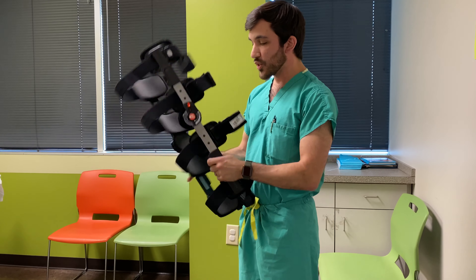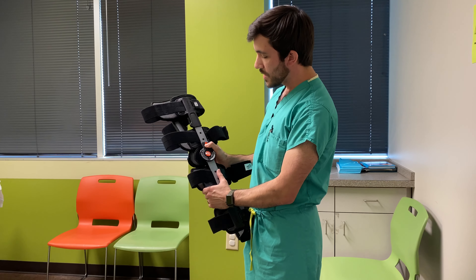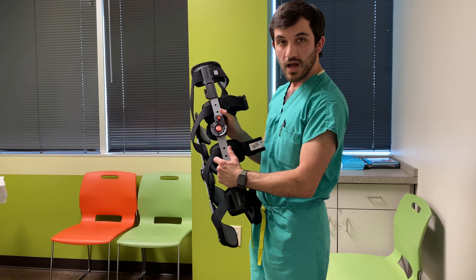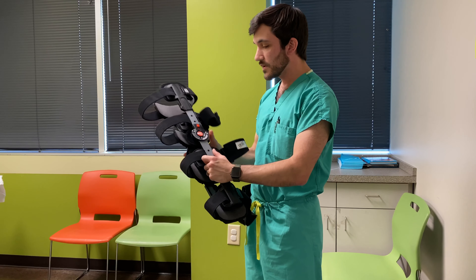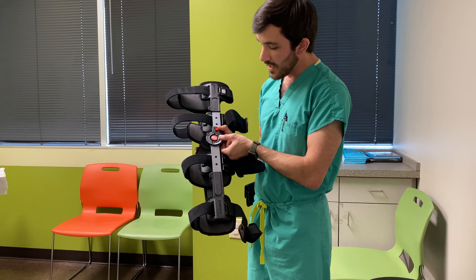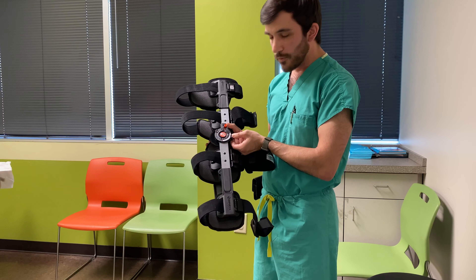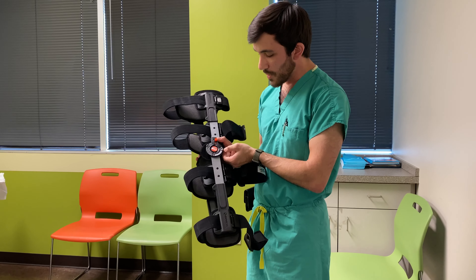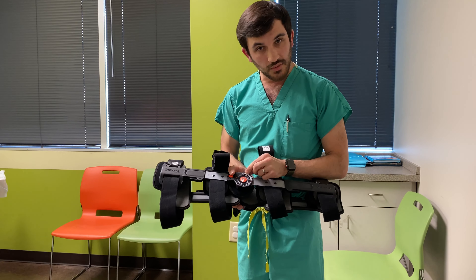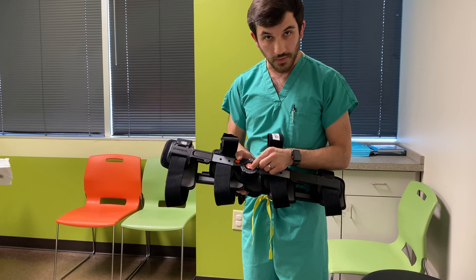The brace is very rigid right now because of the lock button. If you push it up, you'll be able to move the brace. Push it down and it'll lock back in position. How much the brace can move is dependent upon these gray tabs. If you need to change it, you can pull it up and adjust to wherever is necessary. Your provider will likely tell you where this should be set. Note that the white is for extension or straightening of the knee, and the black is for the flexion or bending of the knee.